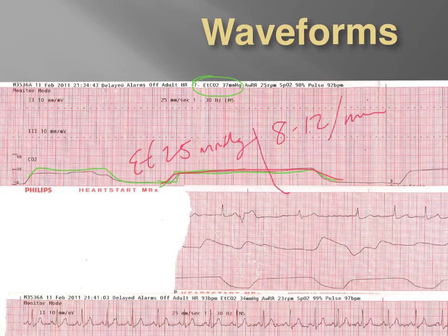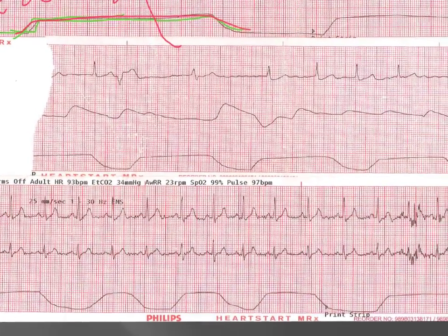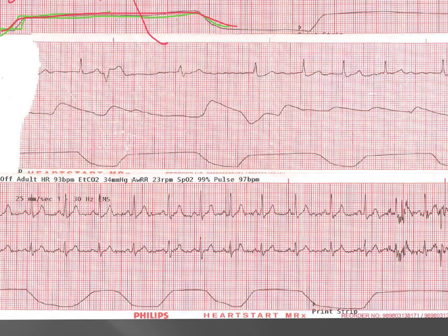Now let's move up here for a second, and these waveforms look a lot better. The middle one here that we just moved to obviously looks much more regular. The waveform is much more crisp, a little bit better looking overall, but we can see the respiratory rate has actually increased a bit more. So this patient might be hyperventilating slightly, maybe a respiratory rate of 20. And the end tidal may also be on this patient 25, somewhere in that area.